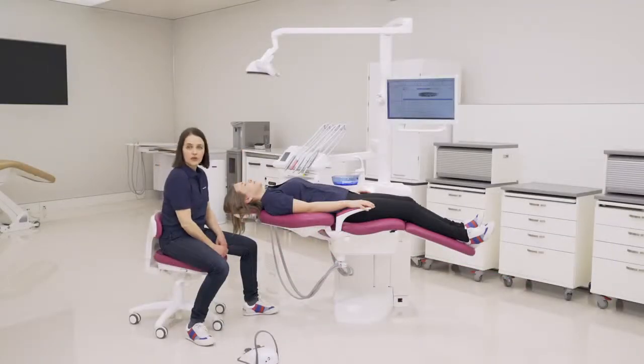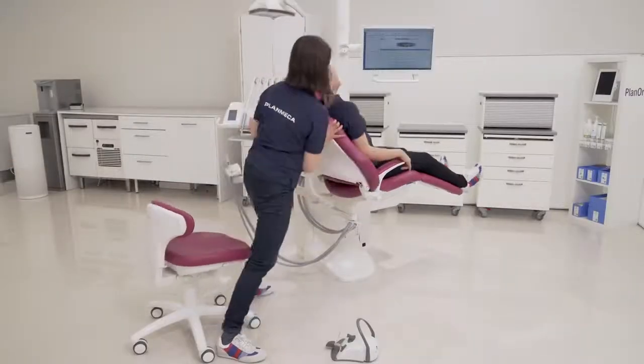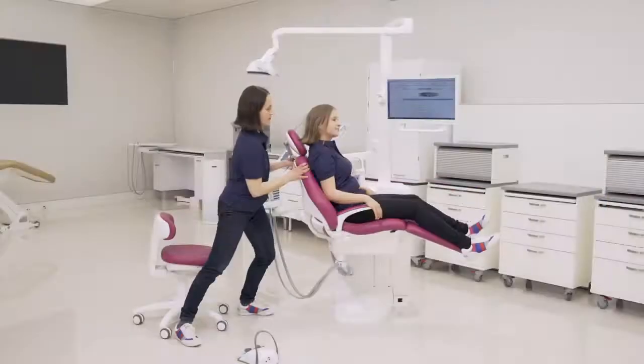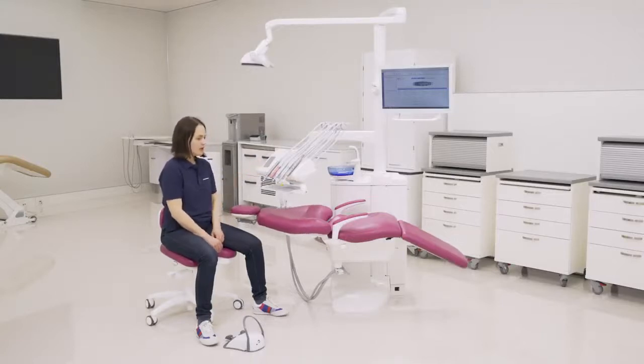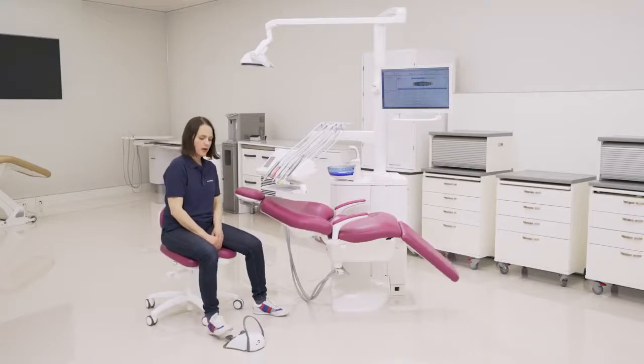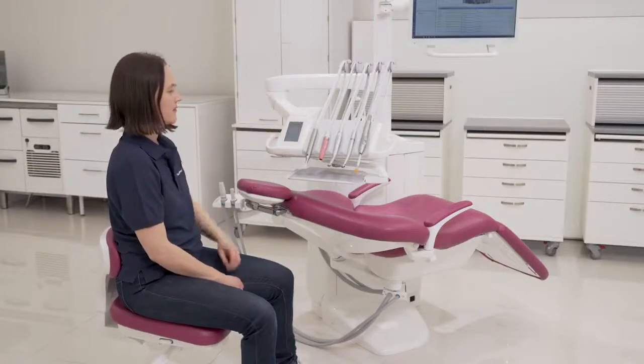In case of emergency, you can get the patient up quickly by pushing manually the backrest up. For whatever reason you have to stop the chair movements, you can do it by pressing any of the foot control buttons or by pressing anywhere in the user interface.